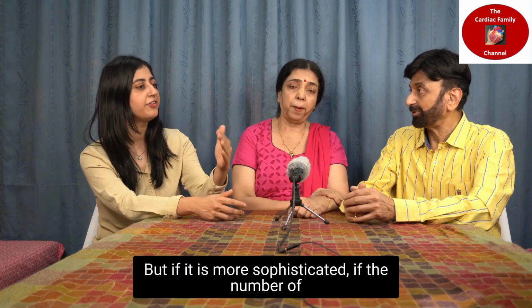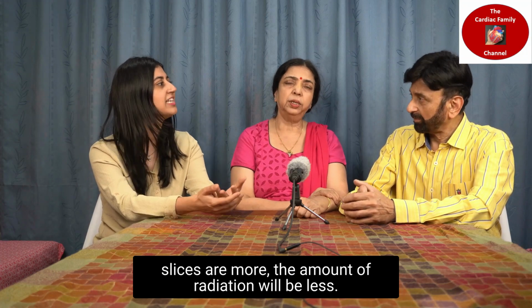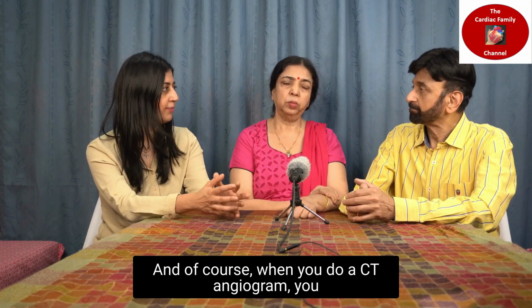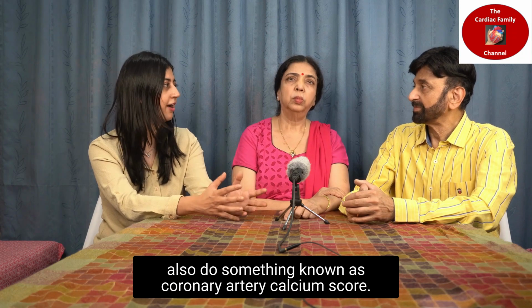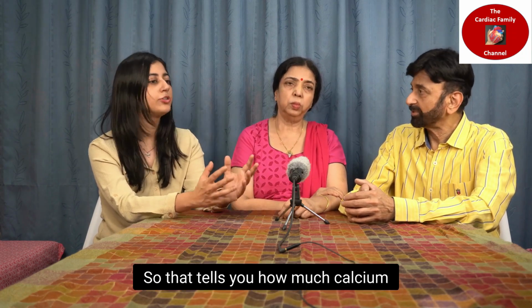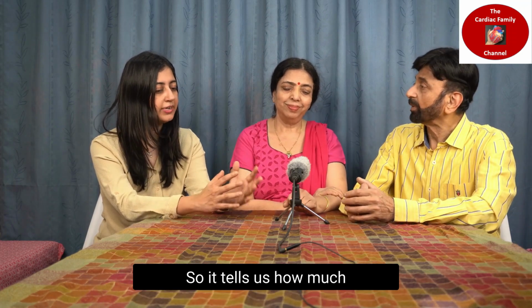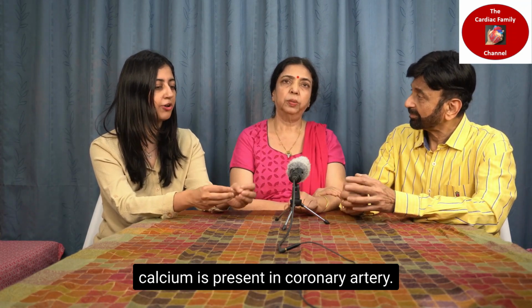Which is quite high. Of course, if it is more sophisticated, if the number of slices is more, the amount of radiation will be less. The radiation is inversely proportional. So this is just a blanket statement. And of course, when you do a CT angiogram, you also do something known as coronary artery calcium score. Calcium score, yes. That tells you how much calcium we have, which we've discussed already in one of the other videos. So it tells us how much calcium is present in the coronary artery.